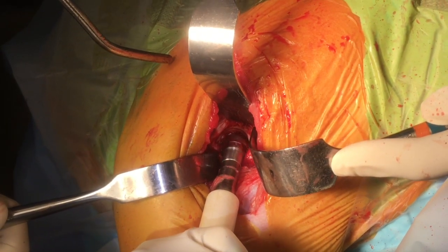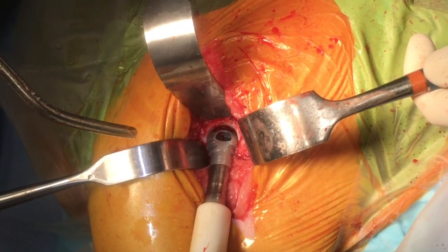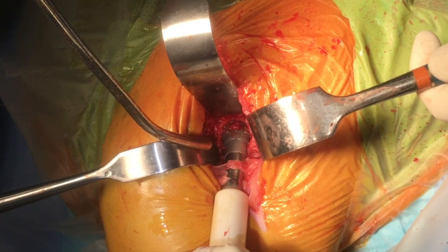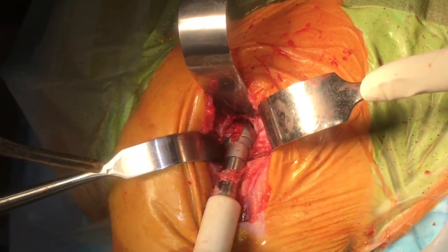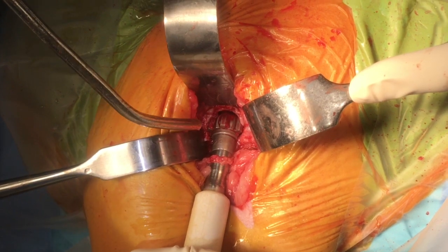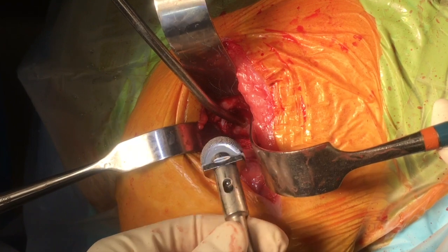We are now ready to ream, ensuring the reamer stays central and does not drift too dorsally, which is the tendency. Reamers are progressively increased in size, checking that we are at the appropriate level within the acetabulum. The finisher reamer is applied, ensuring the same orientation is maintained with each size.